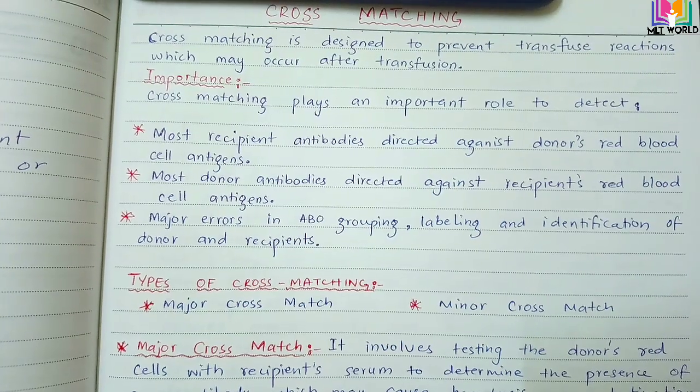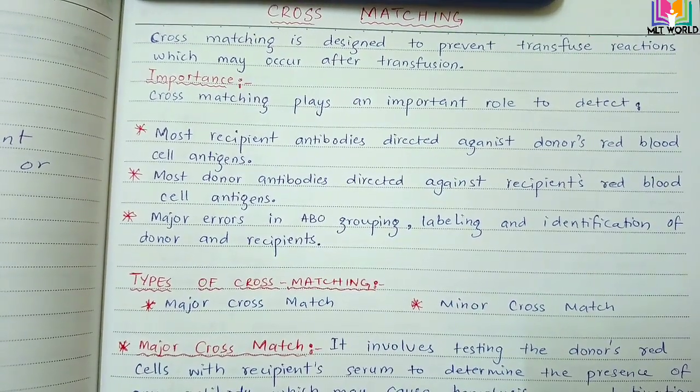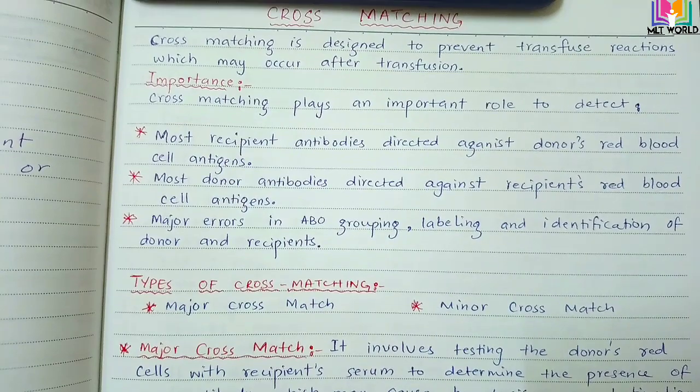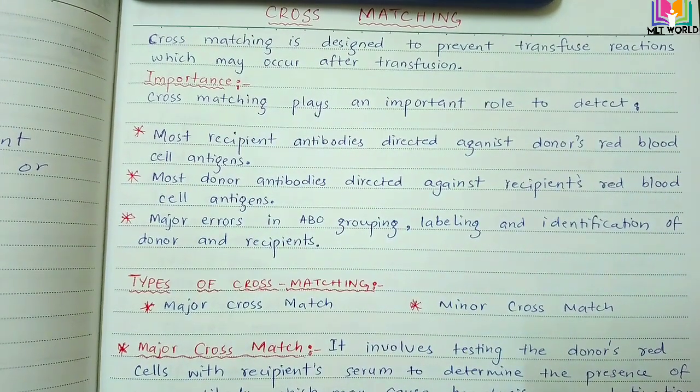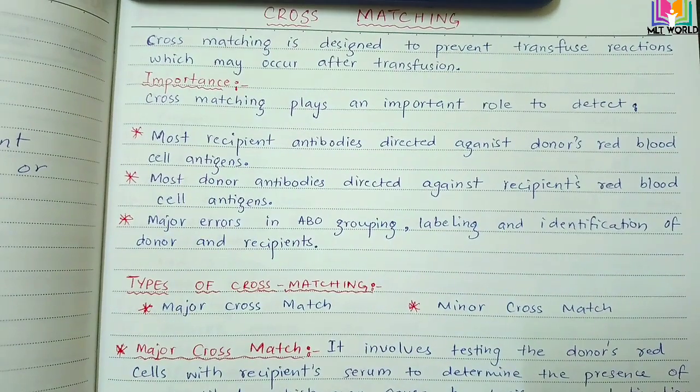Welcome back, friends. Today in this video I will discuss cross matching. What is cross matching? We will discuss types, principle, procedures and interpretation of cross matching.